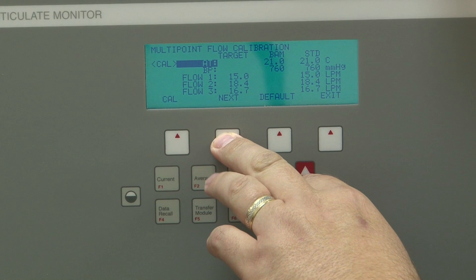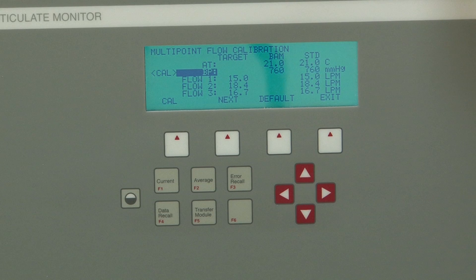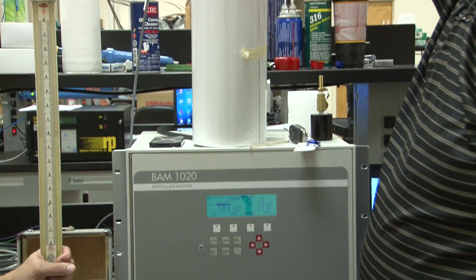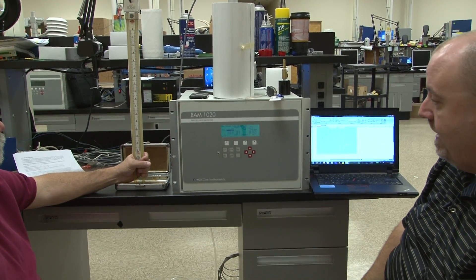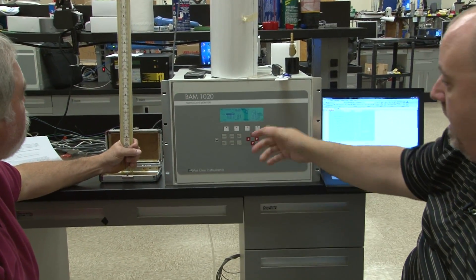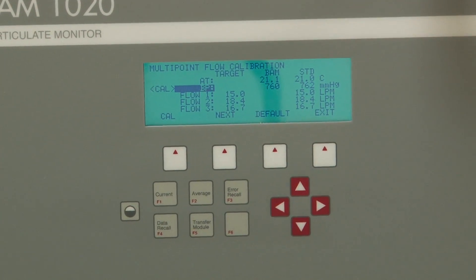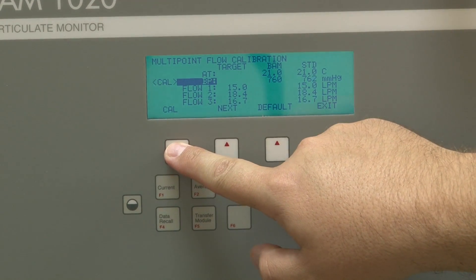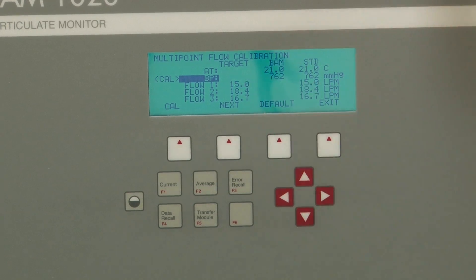Then we're going to calibrate the barometric pressure. You would take your barometer and place it up here — wait until you get a stable reading. On the screen here, for the sake of this argument, it's 762. So at 762, you're going to move the arrow up — it was reading 760 — and hit Calibrate. You'll see now that the BAM is calibrated to 762 millimeters mercury.